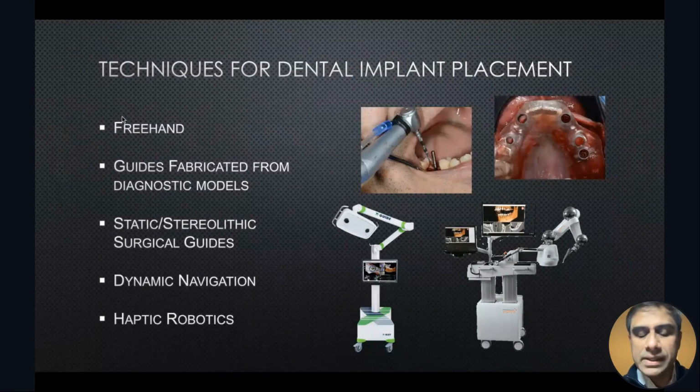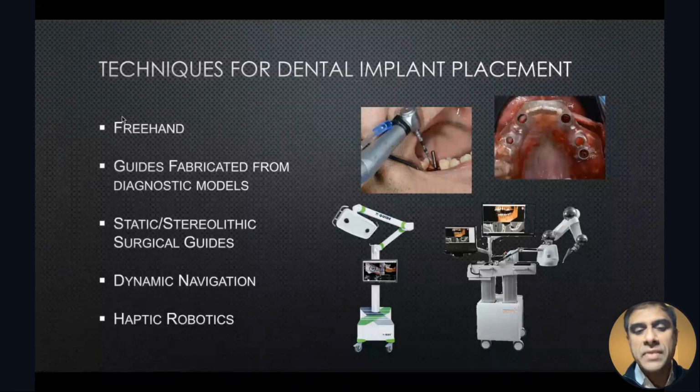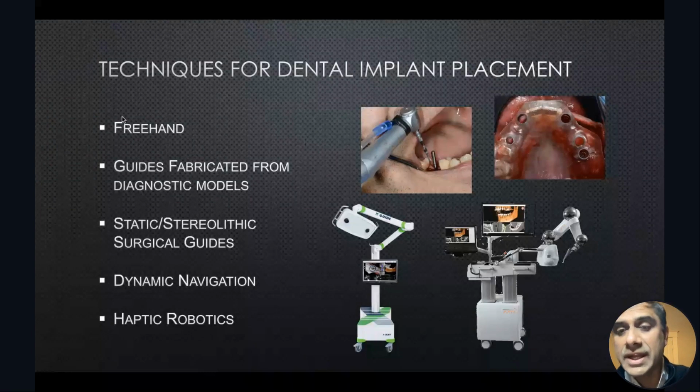And that's why, when I talked about medical legal issues, you're not getting into nerves and other important anatomical landmarks, because there's so much security built into the system in the form of haptic feedback, audio feedback, visual feedback, and of course at the same time your staff are also talking about any issues coming along the way. And more importantly, yes, you can change the plan on the fly, and none of this technology other than just freehand can actually do that. Next slide, please.